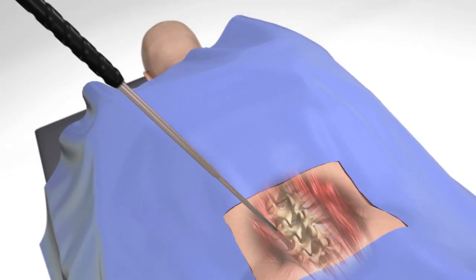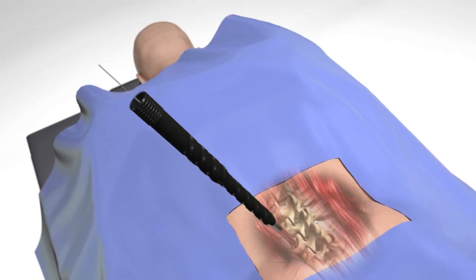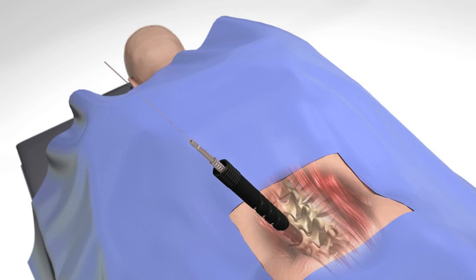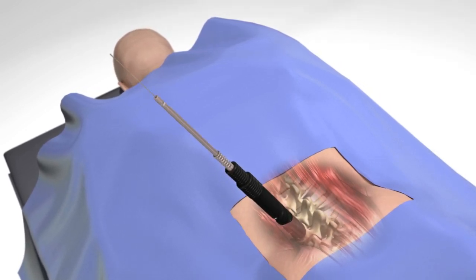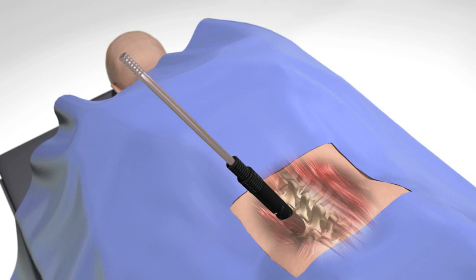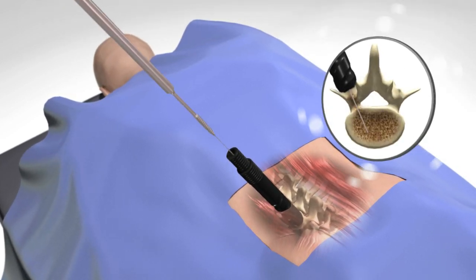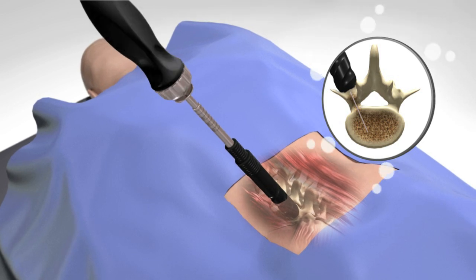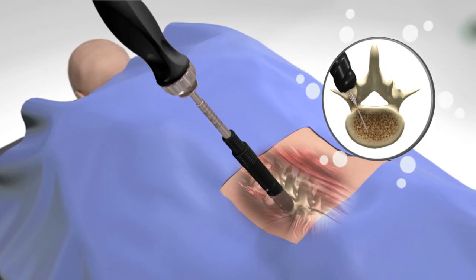Now that the guide wire is in place, sequential dilation of the dilators will begin. Once all dilators have been sequentially placed, remove dilators one and two. Tapping the pedicle can now take place if desired. The advancement of the tap will occur through dilator three.